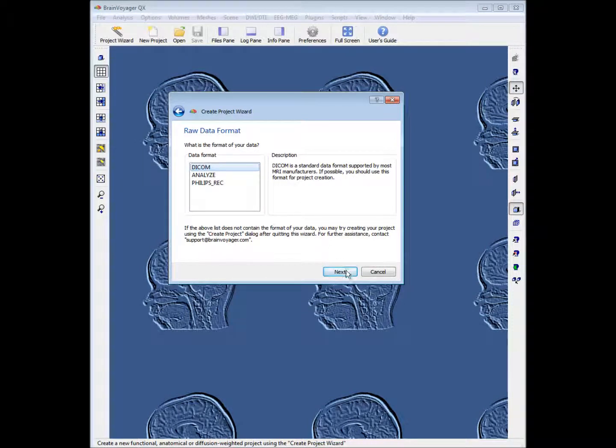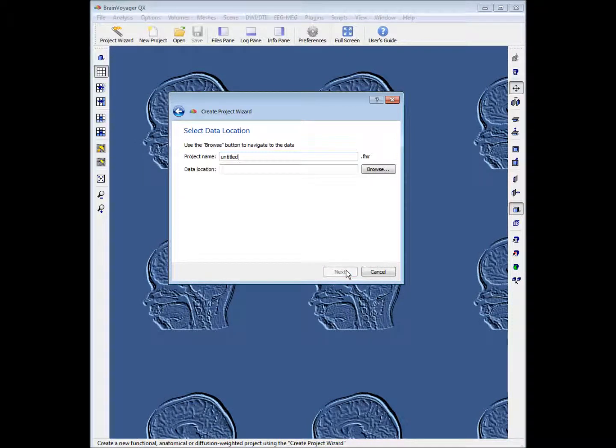Our files are in the DICOM file format — that's fine. In this tutorial we'll call the project cg_objects, so we'll write that.